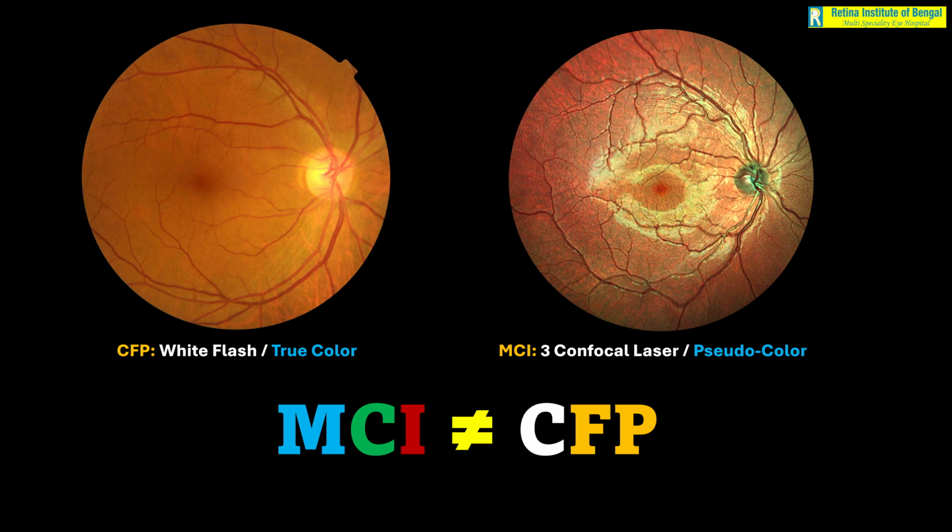Actually, in reality, it is superior to color fundus photo. And I can vouch for that after having now used this diagnostic tool for nearly 2 years in my clinic. So let's see what are the benefits or the edge that multicolor image provides us vis-a-vis color fundus photo.